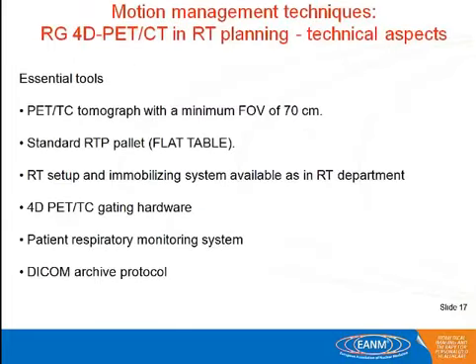What we need: a tomograph with a large enough bore and a flat table, a radiotherapy setup, an immobilization system as used in the department, the PET-CT gating output, a patient respiratory monitoring system, and also a DICOM archive protocol.